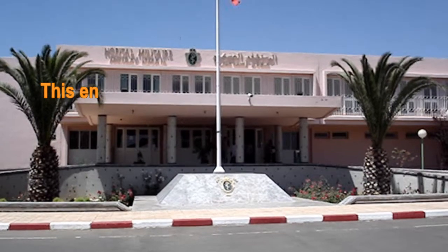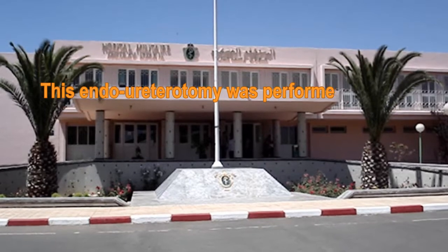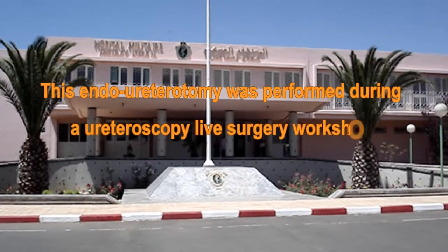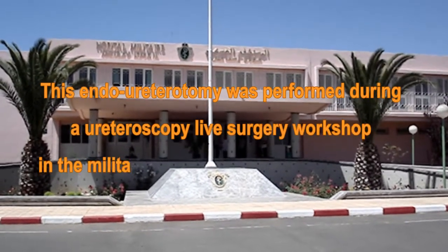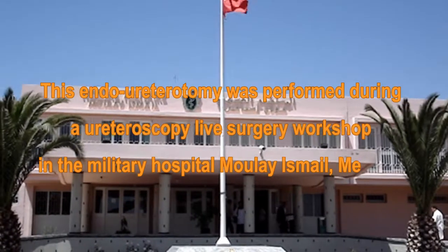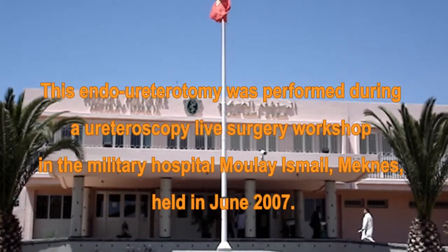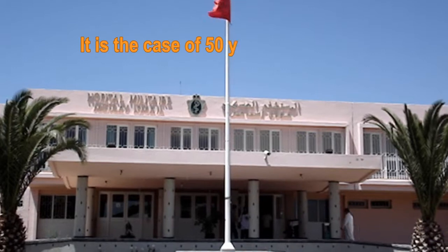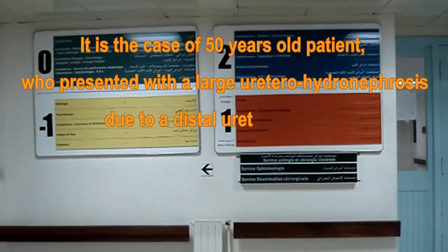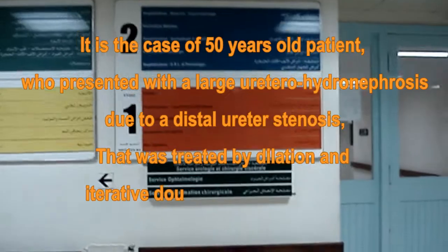This endo-ureterotomy was performed during a live surgery workshop of ureteroscopy in the military hospital Moulay Ismail, Meknes, Morocco, held in June 2007. It is the case of a 50-year-old patient who presented a large ureterohydronephrosis due to distal ureteral stenosis.